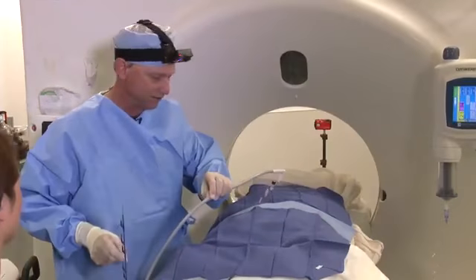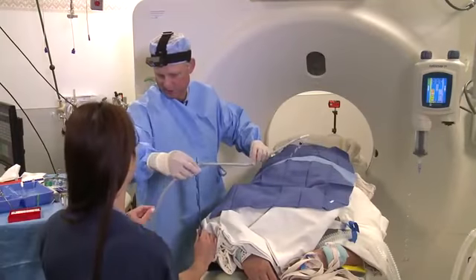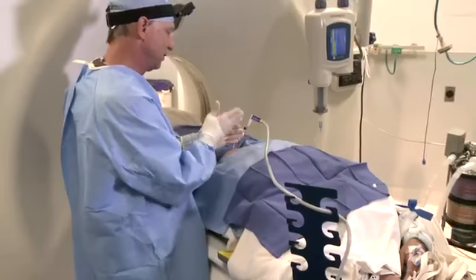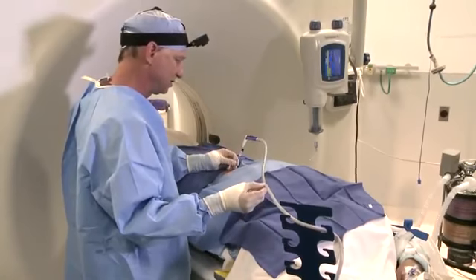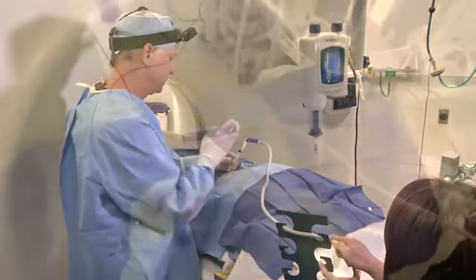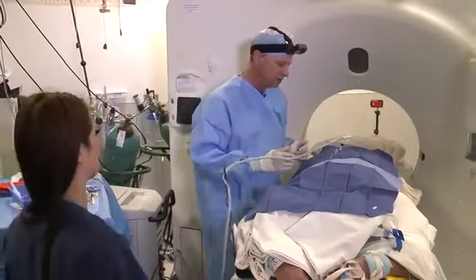This is a handy little device that helps tremendously in trailing the cords. The secret with this device is to bring your probe into axis. Here it's tipped cephalically, so if I just pull a little bit, and Michelle can help me, it's perpendicular now, and when we take our scan, we'll see the whole needle.